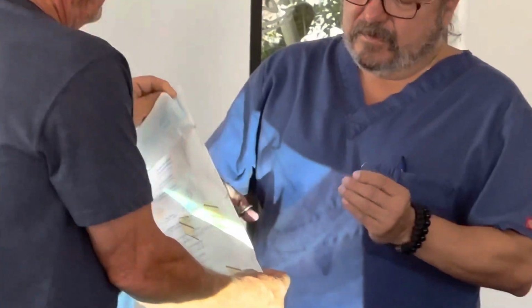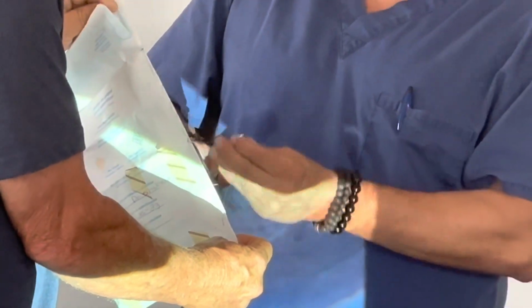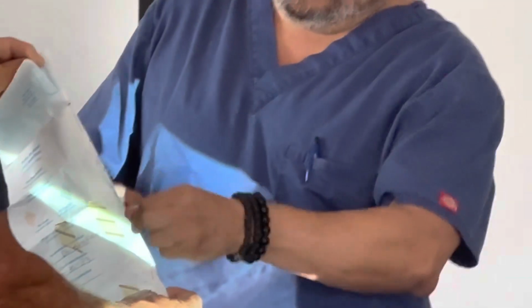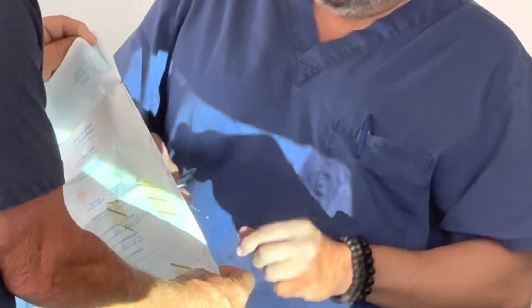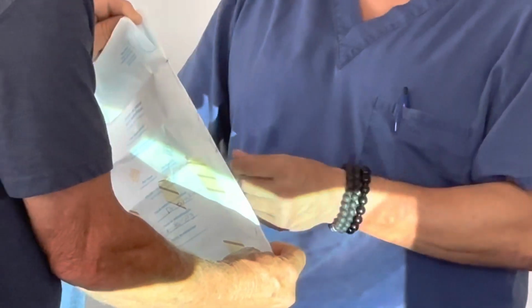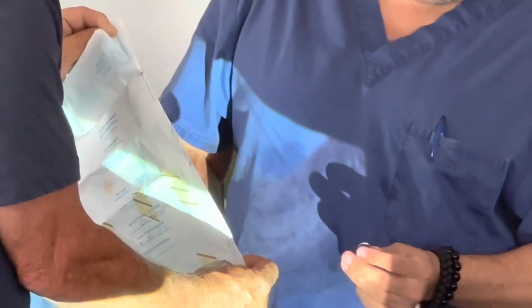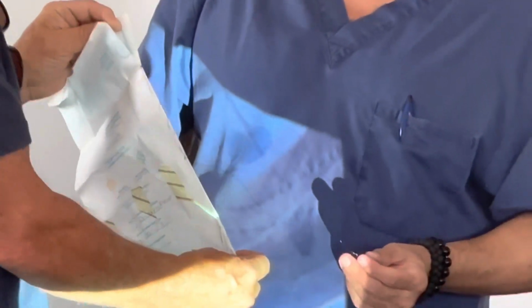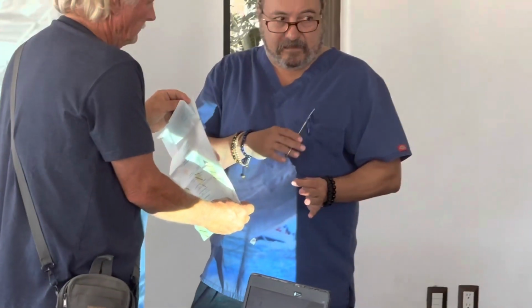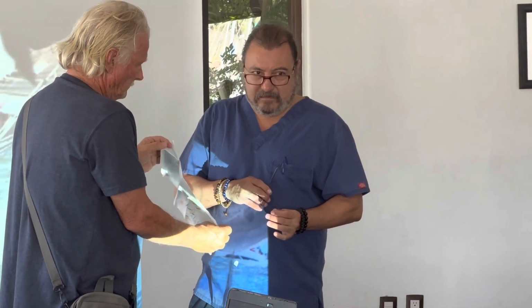And what we're gonna do is go in between. One, two, grab onto the last little string, and leave a little loop. Go in, one, grab, loop, grab, loop. Oh, you're pulling it over the top of the instrument. Yep, exactly. Okay, was that self-explanatory, or did I explain okay?